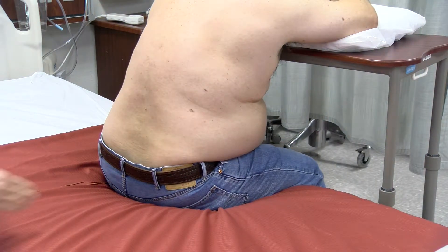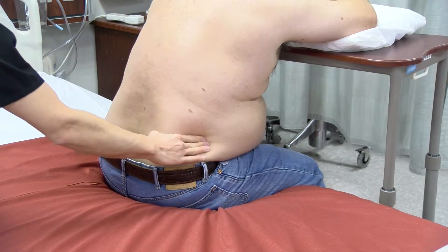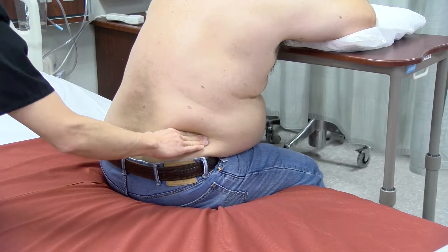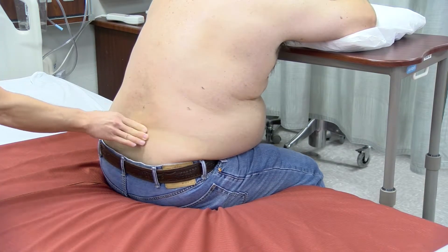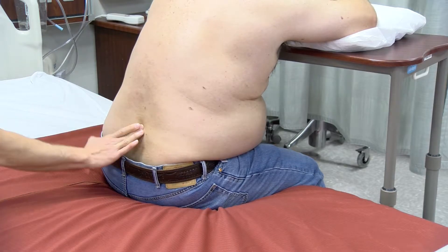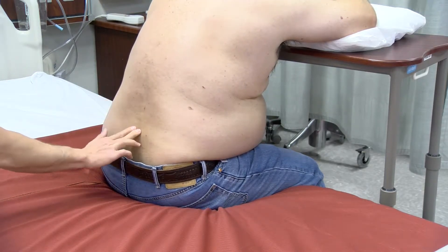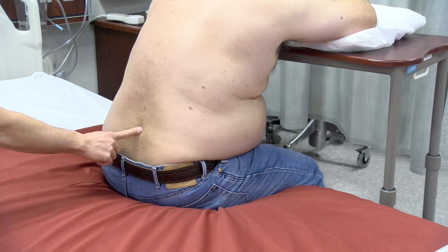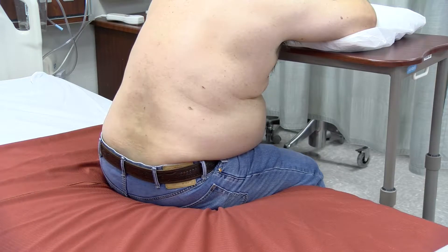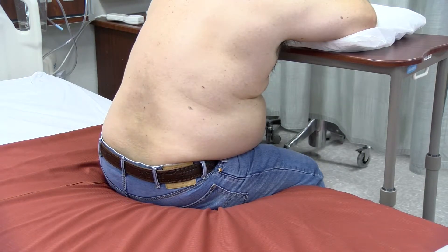Begin by palpating and identifying landmarks. The most commonly used landmark is the iliac crest of the patient. Followed horizontally, this space lines up with the L4-L5 interspace. The space above and below this level may also be used for insertion.